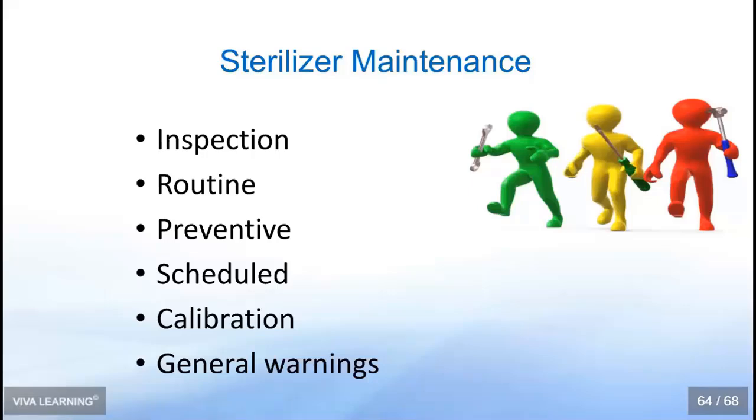So again, write these things down when you do them. And as far as calibration, each manufacturer is going to have a recommendation for a formal service calibration, which obviously has to be done by a technician. An example of calibration may be every 3 years or every 3,000 cycles. I'm not making that as a general recommendation. I'm just giving that to you as an example.